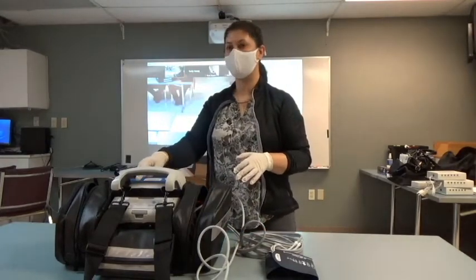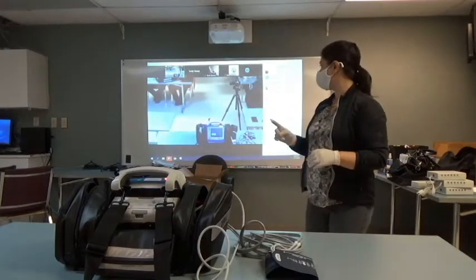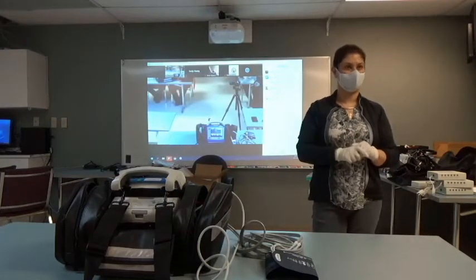All right, let's go ahead and turn this on. Green button up at the top. It's going to run through that operational test where the lights are going to pop up on the top. It's also going to check our printer.